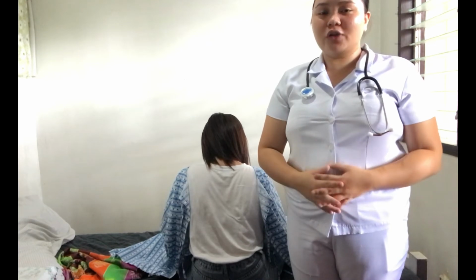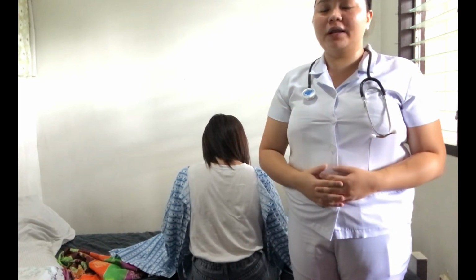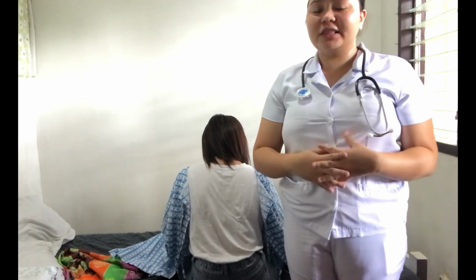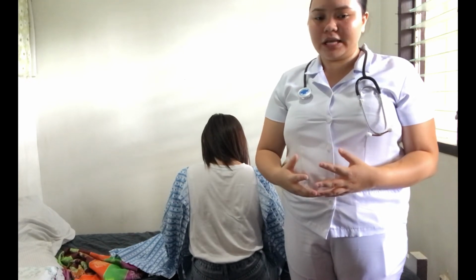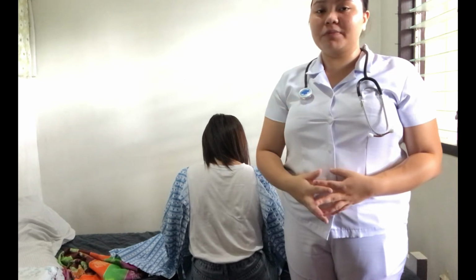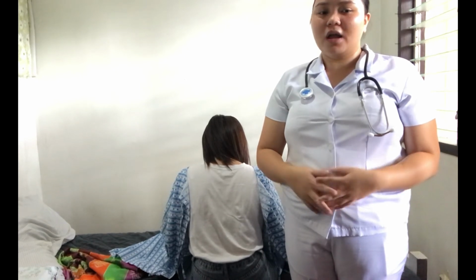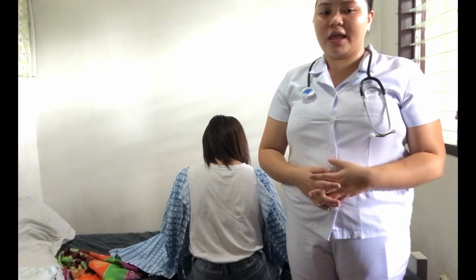So now we're going to auscultate for breath sounds. Place the diaphragm of the stethoscope firmly and directly on the posterior chest wall. Ask the client to breathe deeply through the mouth for each area of auscultation. We will do this procedure using the flat disc diaphragm of the stethoscope as it's best for transmitting sound with high pitch breath sounds. And we will use the zigzag procedure to assess airflow through the airways.